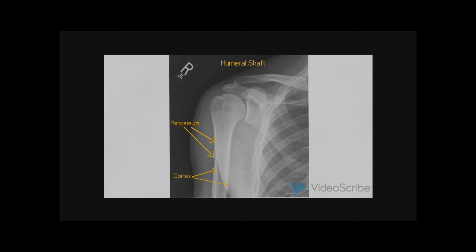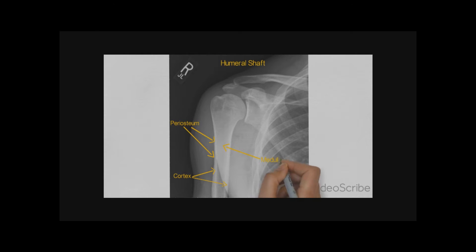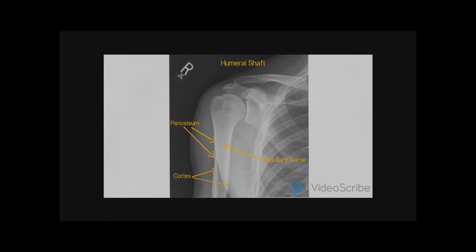The cortex needs to be continuous with consistent density and thickness. Then we need to look at the medullary canal. Once again, we assess for density, consistency, and for any intraosseous lesions.